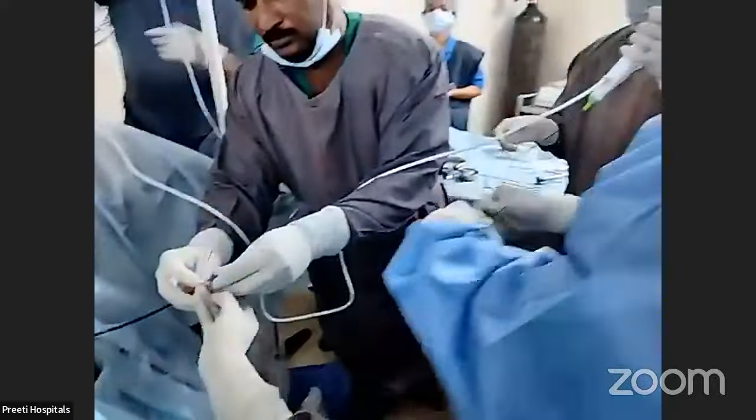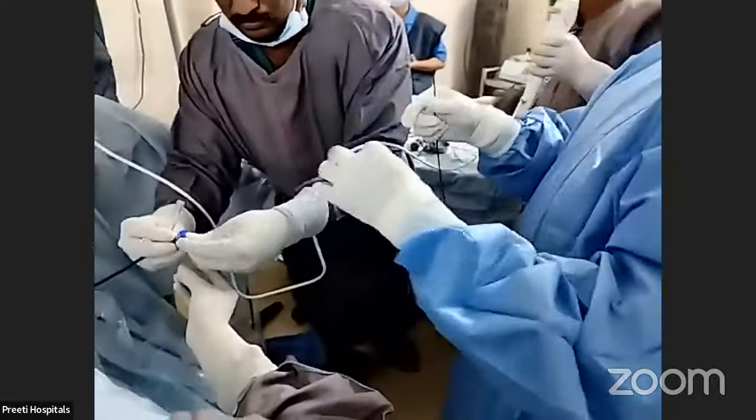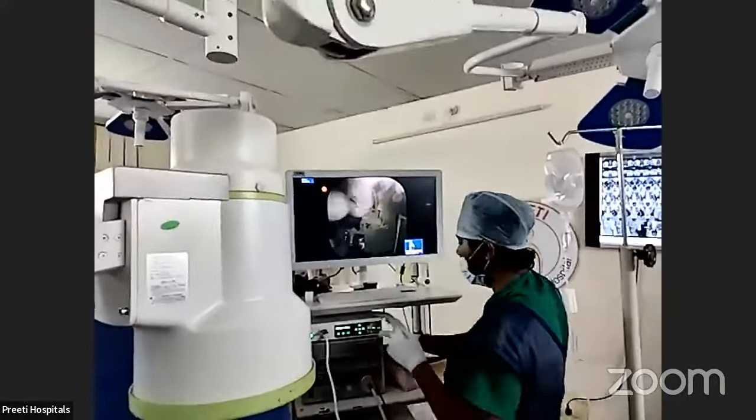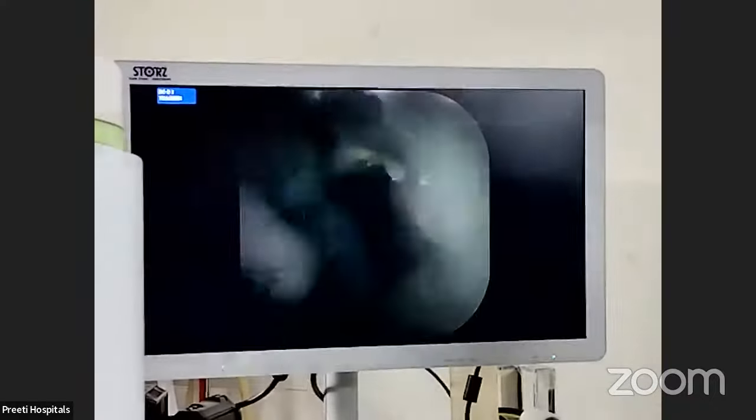Now camera, white balancing is done. Now we have to exchange the camera. So how is it exchanged? And now white balance to be done. Then you do it if it is required. Benefit of doubt, do it. White balancing, yes. Now you go.